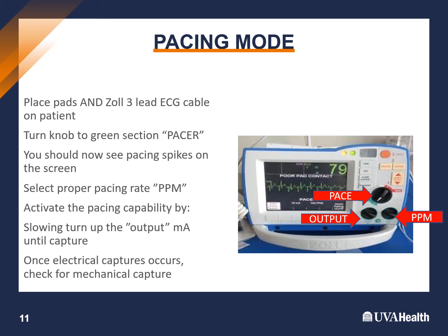It should feel and correlate exactly to what you have the rate at as well. Maybe if they have an arterial line, you'll see an increase in your waveform, or your rate will now match what your pace beats per minute is. If you are pacing this patient and he has an increase in cardiac output, which he should once he has good capture and increased perfusion, he may start crying. If he starts crying and his heart rate goes above whatever your preset rate of pace beats per minute is, the pacemaker will stop, because it's only on demand.